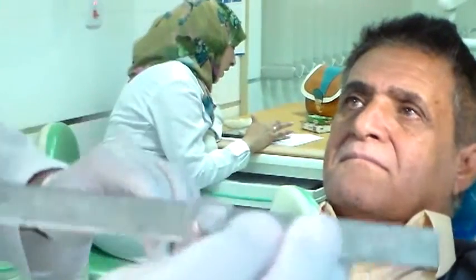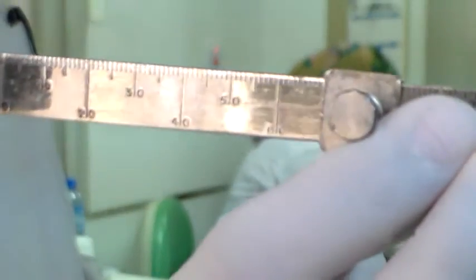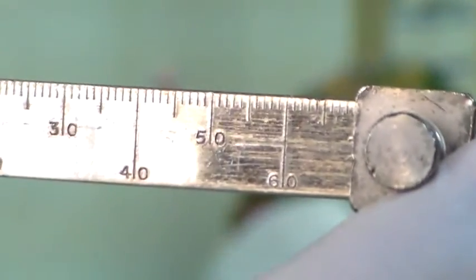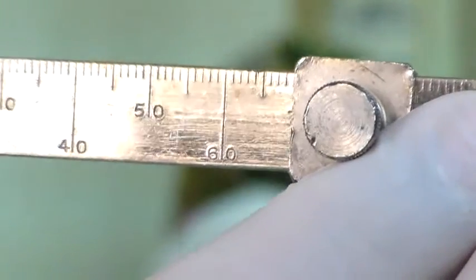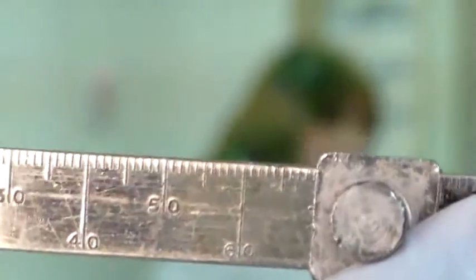This time the reading seems to have changed. It's gone to 69 now, so that means he's getting more relaxed. Let's check it again. Write it down though.